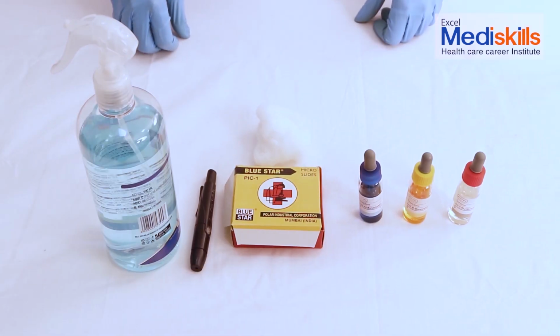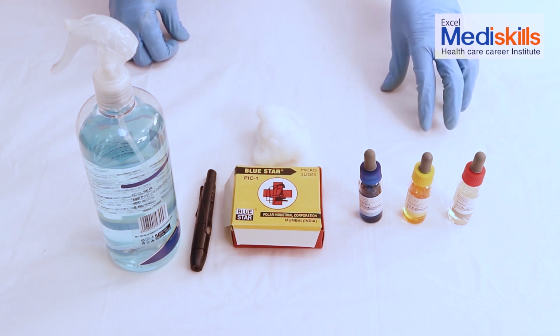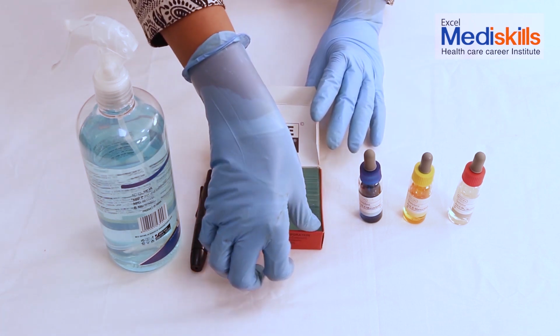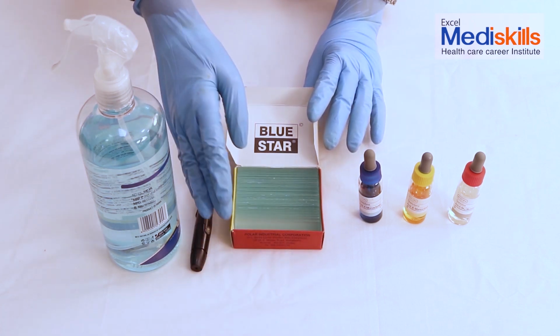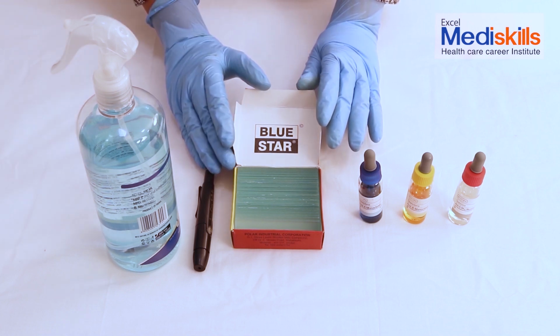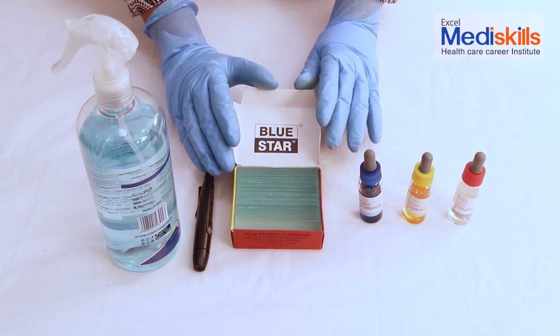Now we will see what are the ingredients required for the detection of blood group. First, glass slides. Here you can see a number of glass slides which are sterile. But even then, we will sterilize or disinfect them with the help of this disinfectant. And then we will collect the blood drops on these slides.